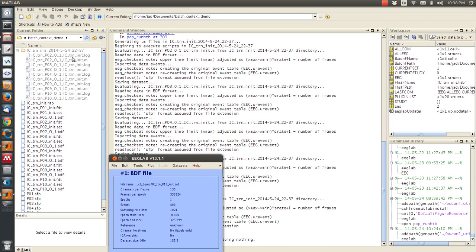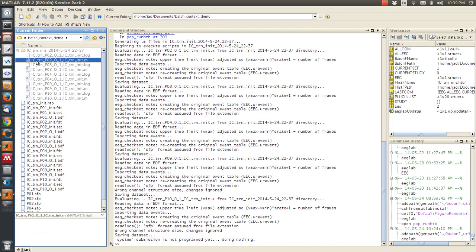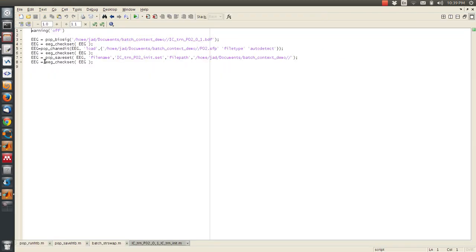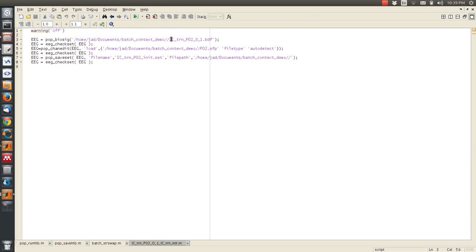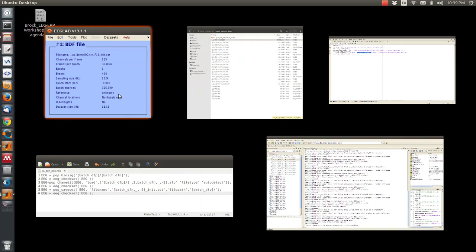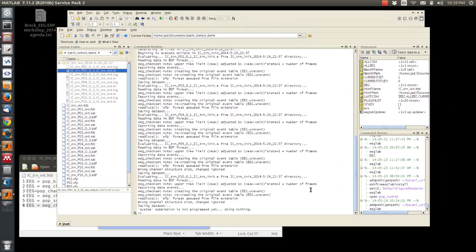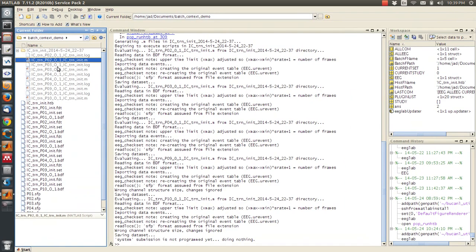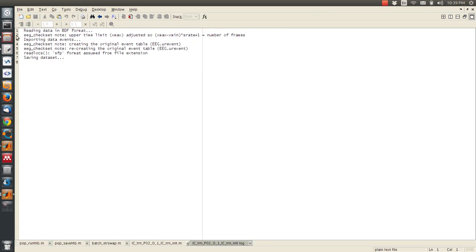And here we can see that in the timestamped folder, an M file was created for PO2. And if we load this up, we can see that it went to the right directory and then loaded this file, found the SFP file for that specific subject, and then named the output file this. And then if we check the log for that, this is basically what was printed to the command line during the execution of this one file.